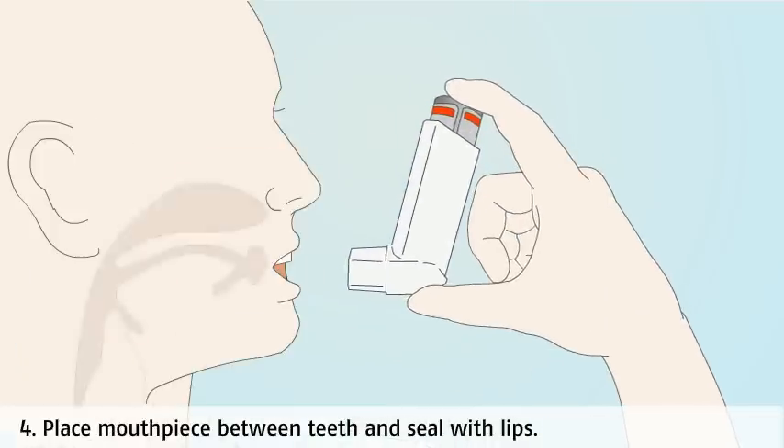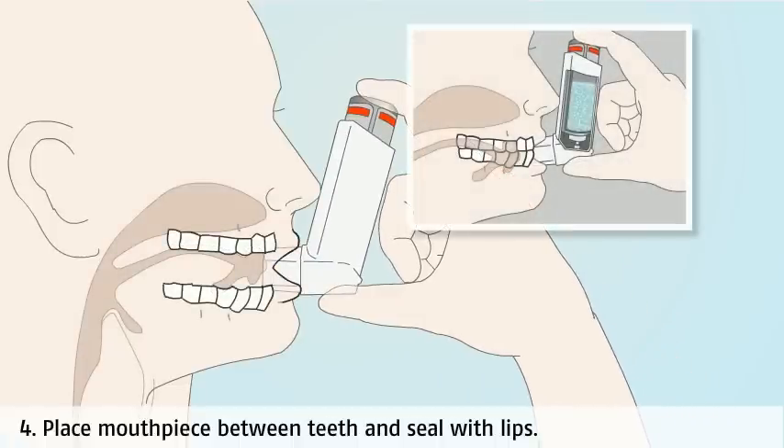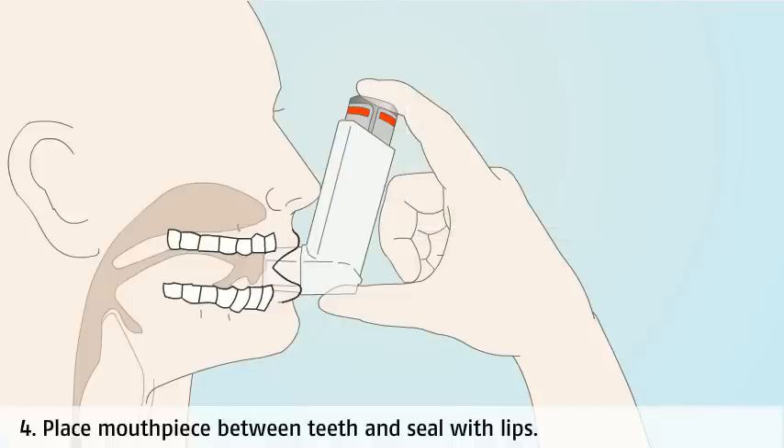Place your teeth on the mouthpiece and close your lips around it. This prevents the teeth being sprayed and creates a good seal with your lips so that the medicine doesn't escape.